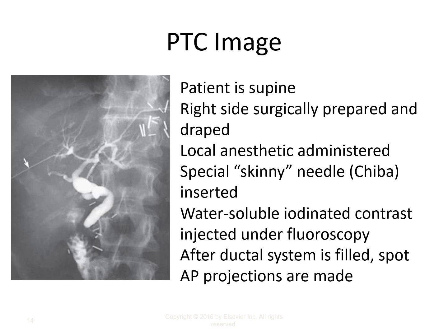I don't specifically see a gallbladder filling up. They may or may not still have a gallbladder. It might be just early in the injection and the gallbladder hasn't filled just yet, and it's in this empty space in the lower right hand corner of the image.